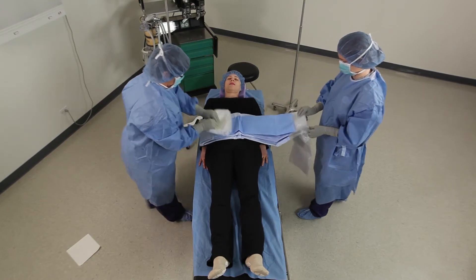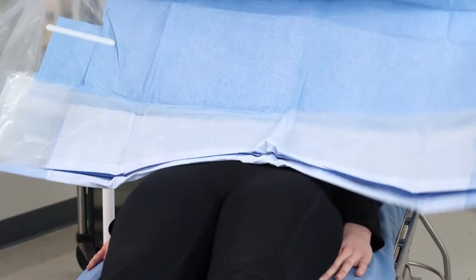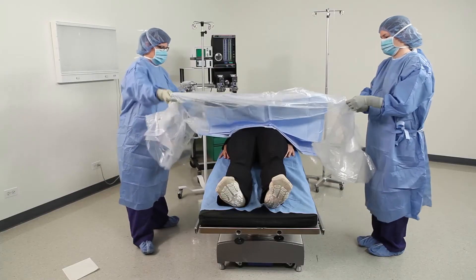Unfold the drape to the head. Next, unfold to the feet.